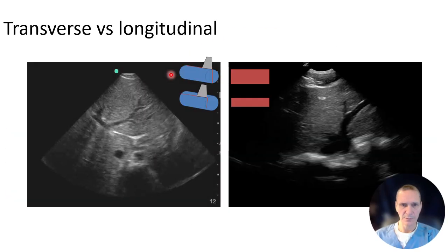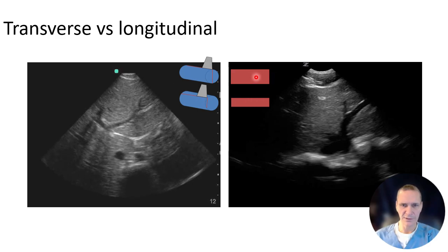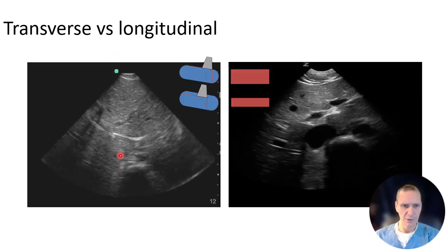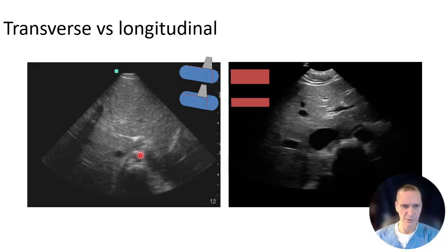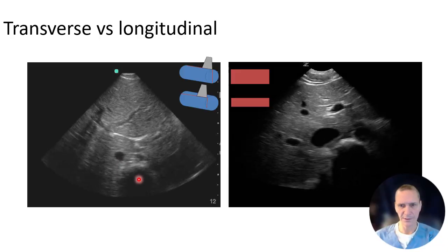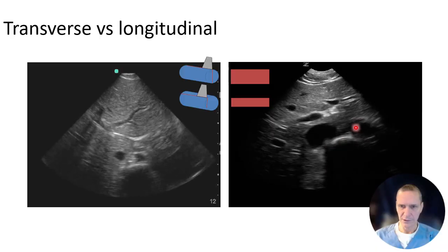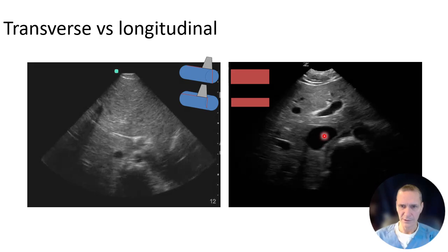We talked in the prior slide about how being on the wrong plane can actually change the size of the IVC quite significantly. One way to overcome that is to obtain the view in the transverse view. So IVC is on the left here, the aorta is here, and that's going to give you more of a complete view of the IVC. Here we see the aorta here, the IVC here.